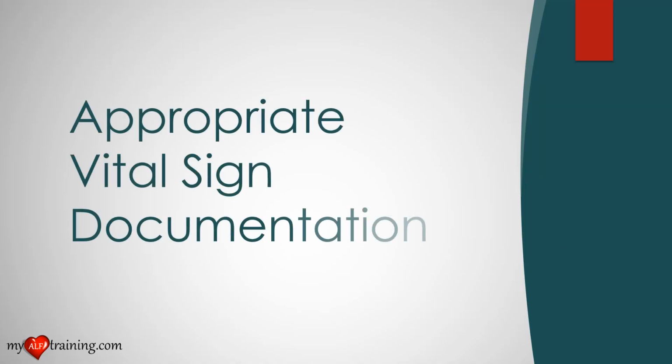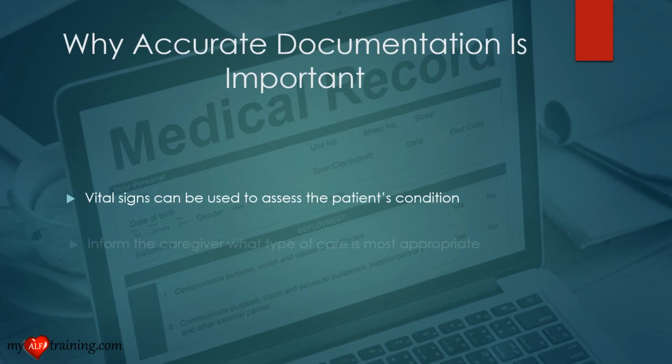Once you have taken your vital signs, you need to appropriately document them. Accurate vital sign documentation is extremely important. This is because vital signs can be used to assess the patient's condition and overall health status. Vital signs also inform the caregiver what type of care intervention may be most appropriate.